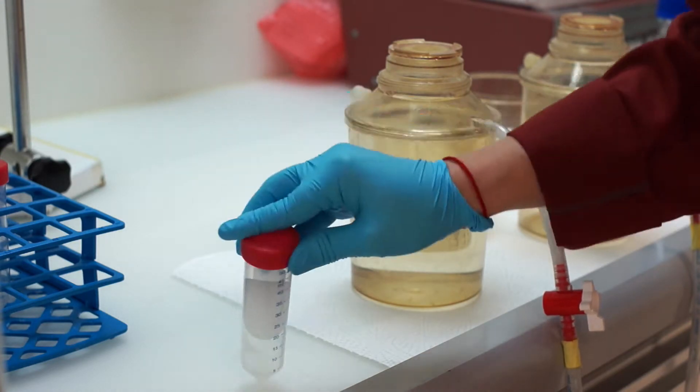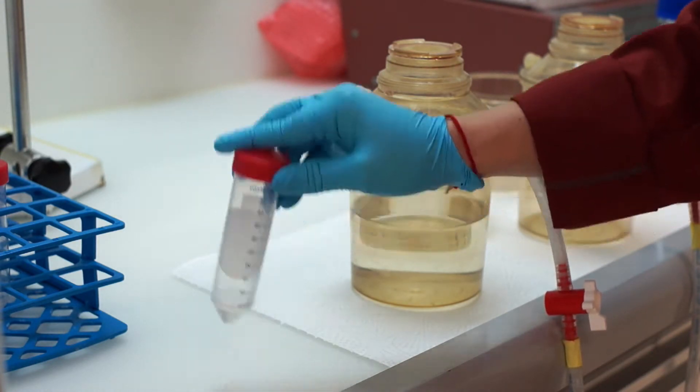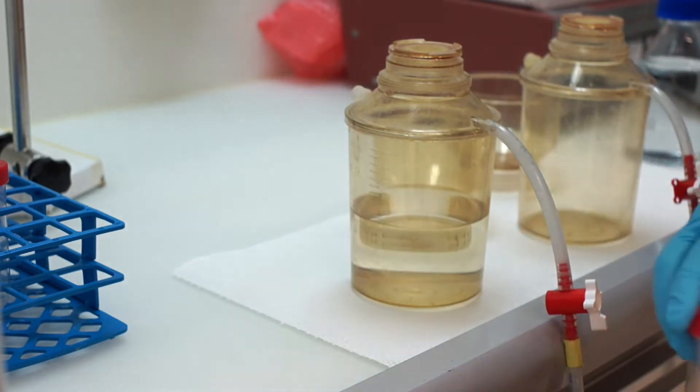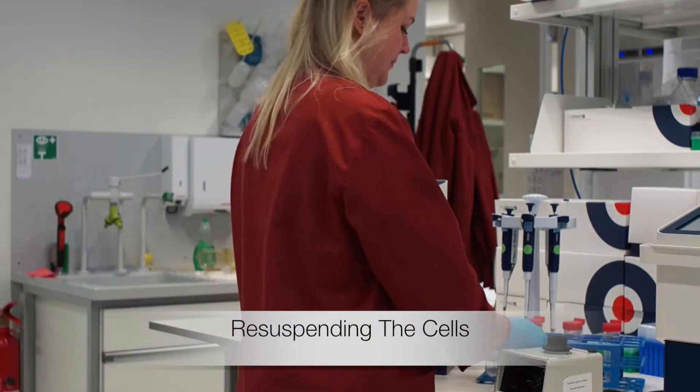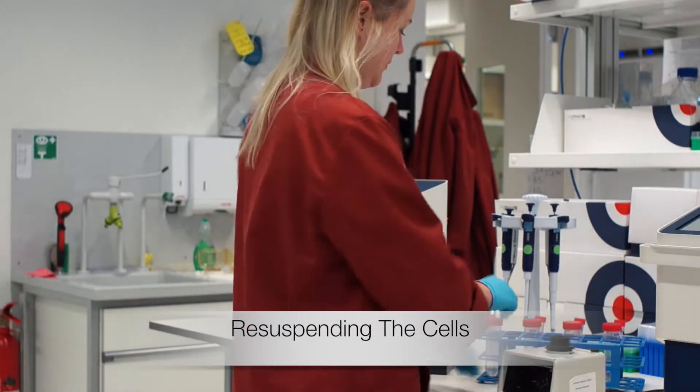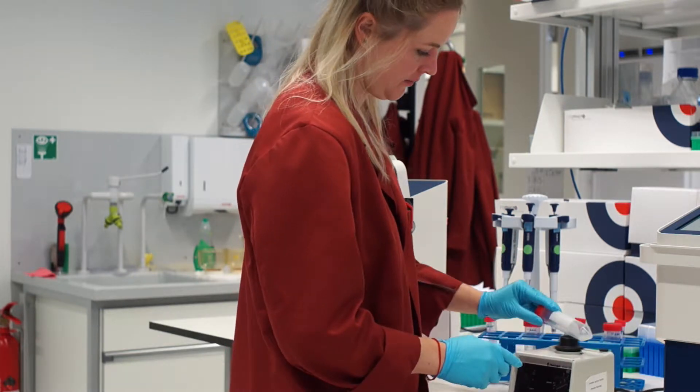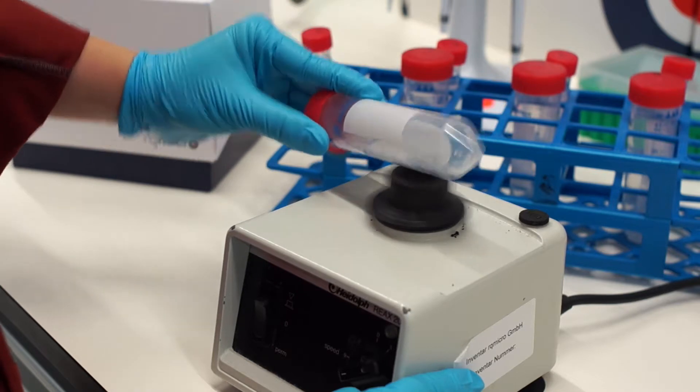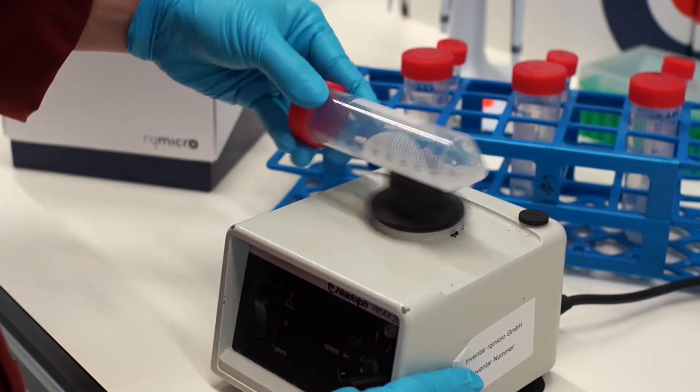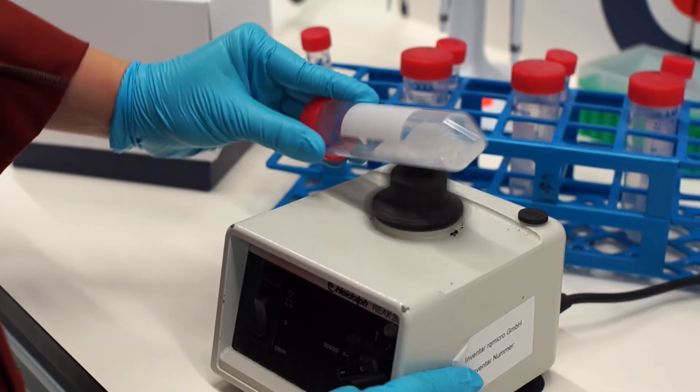By tapping the tube on a hard surface the filter moves to the lower part of the tube. By vortexing the tube for 30 seconds I'm creating turbulence on the surface of the filter and thereby resuspend the cells in buffer. The filter might move back and forth but it should always lie flat on the inner wall of the falcon tube.